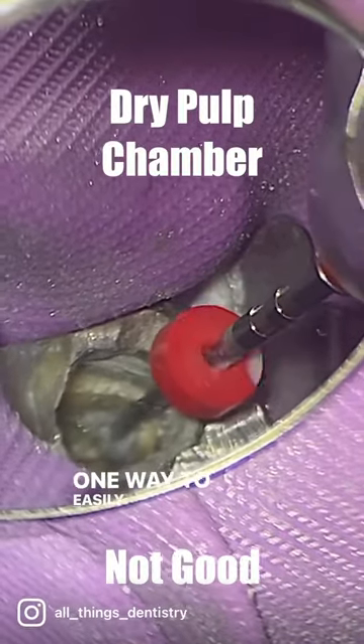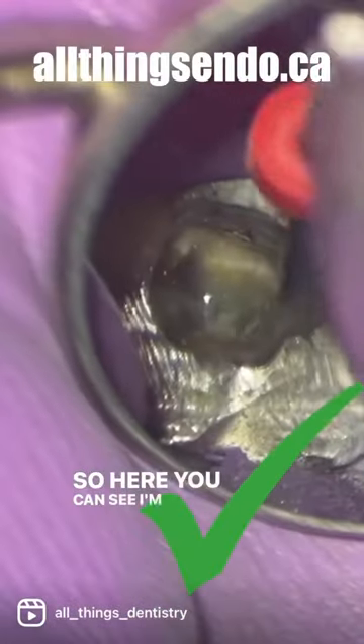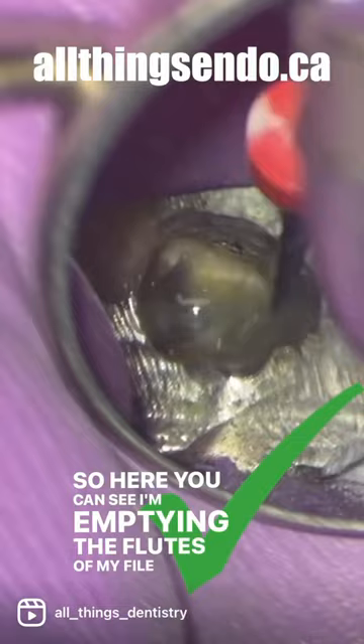We're trying to prevent that. One way to easily do that is just to keep your pulp chamber full of irrigant — usually it's hypo for me. Here you can see I'm emptying the flutes of my file in the irrigant.